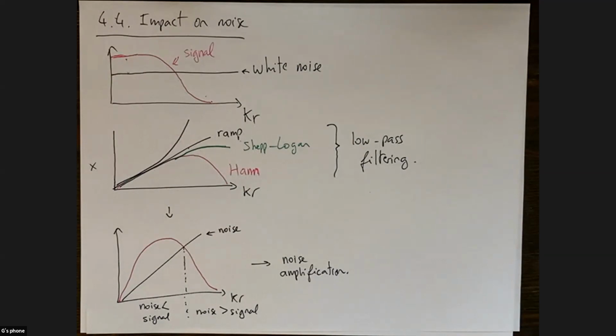Can I say something again? We're very count starved in molecular imaging generally, especially in PET and SPECT radionuclide methods. So you always have a lot of high statistical noise, so low statistical quality data. And so in addition to sharp edges being enhanced by enhancing high spatial frequencies, the very sharp changes in counts that you see as a result of low statistics would also get enhanced if you amplify the high frequencies.